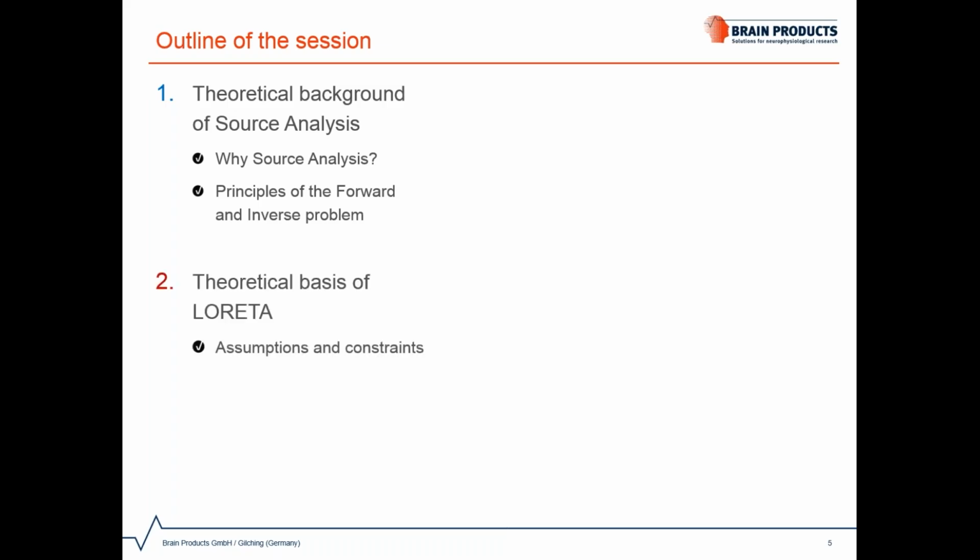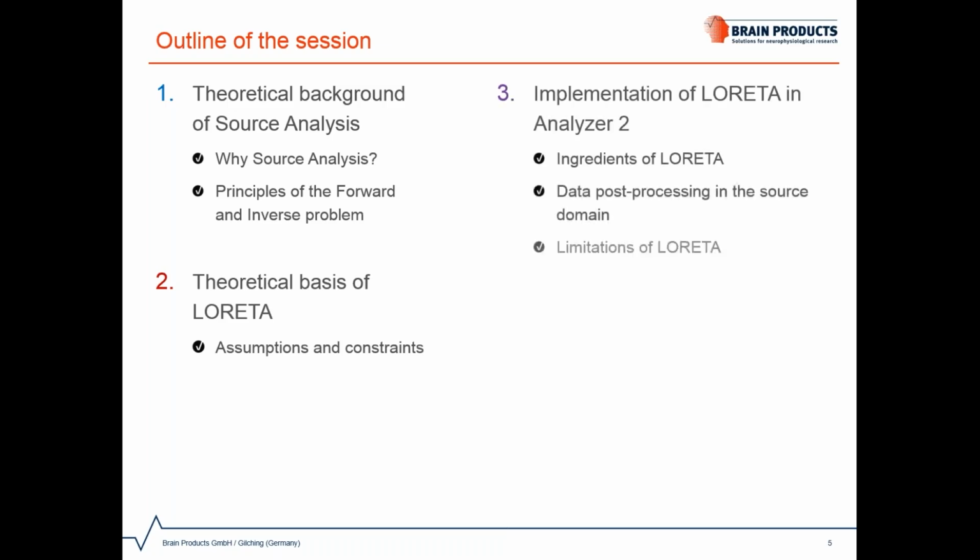In the second section, we will focus on LORETA and talk about its theoretical basis. Then the third section will be about getting to know its implementation in Analyzer, including its limitations, and also creating awareness of certain rules about what should and should not be done before applying LORETA in Analyzer.